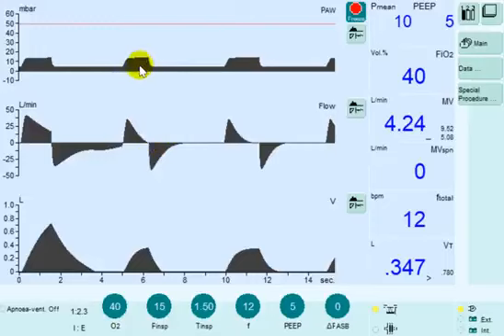Both cases will result in the same pressure but less tidal volume. However, with decreased compliance, the lung is stiff and empties faster, resulting in higher peak expiratory flow and shorter expiration.